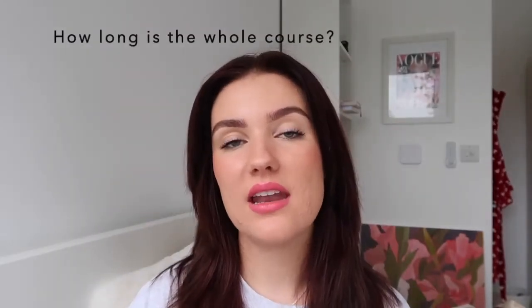Someone has asked how long is the course. I know it's a bit of an annoying answer, but it really does vary from person to person. They say it's normally about 6 months to 18 months. I would say generally it takes about a year. It really depends how your teeth respond to the treatment, because someone said, what happens after, do your teeth move back? Retainers. So yes, your teeth are always moving.